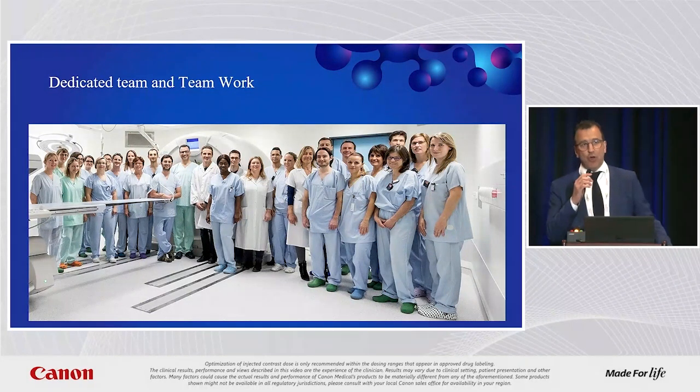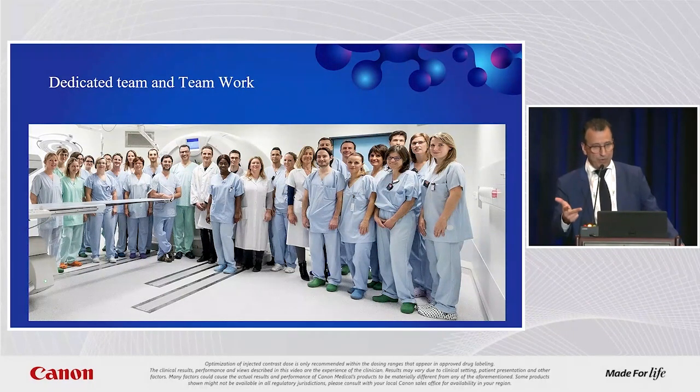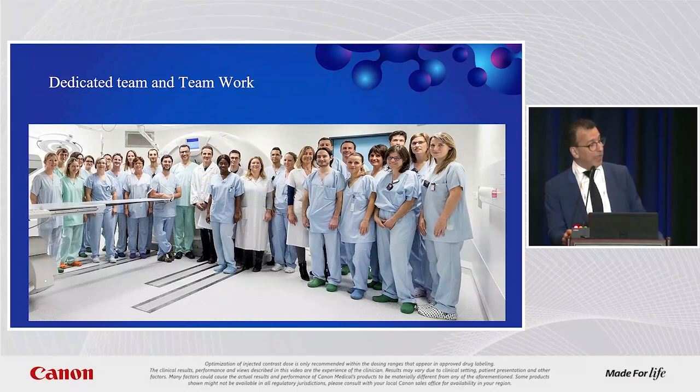The question was how long it takes me to do the case. You block the room for 4 hours. I know that's expensive, but those are exceptional cases. And every time, as I said, when you see the patient on consultation, we have a form. You have to say which room you're operating in, which specialist you need, what materials you need, and how long you want the room. That's important. Again, all these rooms are dedicated for interventional.